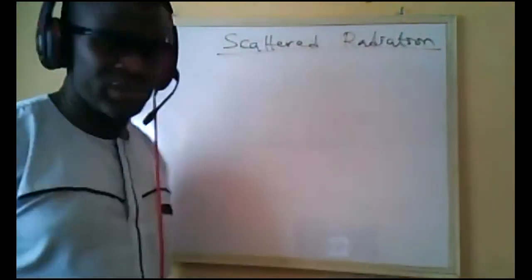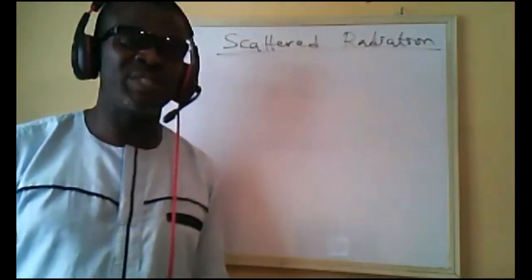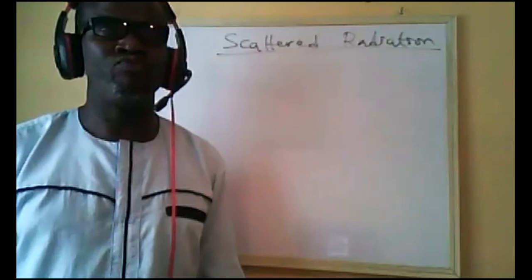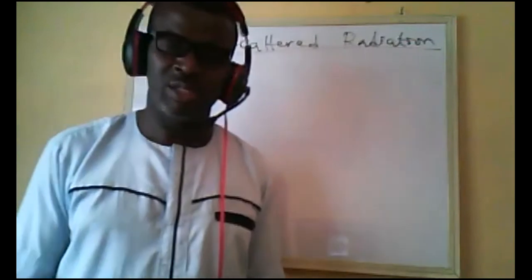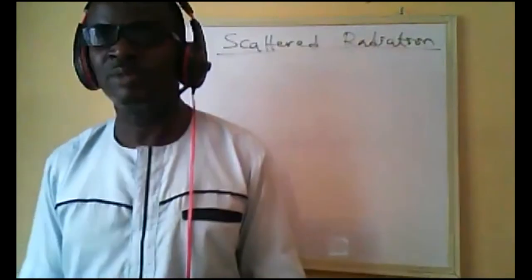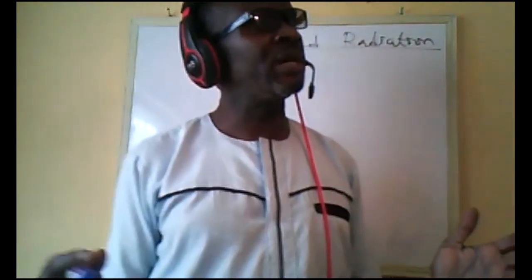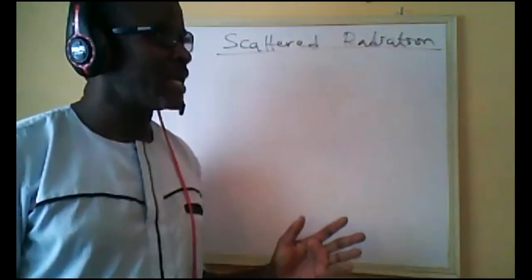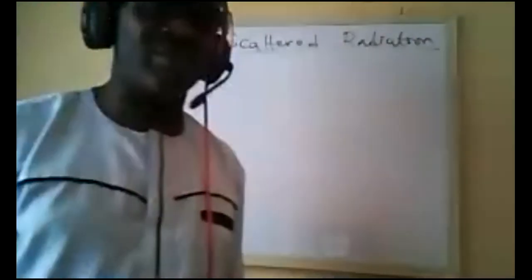So we want to reduce scattering as much as possible, especially in fluoroscopy, whereby the fluoroscopist or maybe the neurosurgeon or the orthopedic surgeon, as the case may be, might need to be inside with the patient. So reduction in scatter radiation is also a way of reducing the dose the physician absorbs, no matter what.